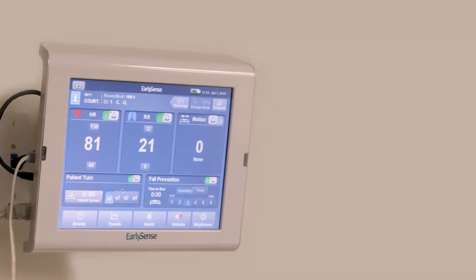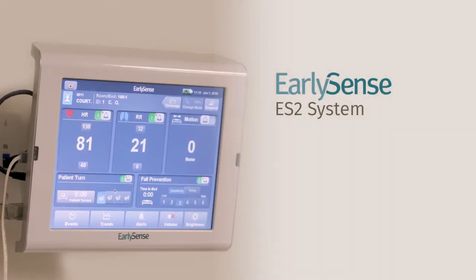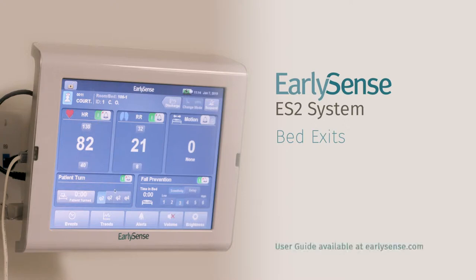Welcome to the EarlySense tutorial video. This video will demonstrate how to utilize the bed exit functionality for fall risk patients. For any elaboration on how to operate the EarlySense system, please refer to the relevant user guide provided upon installation or online at EarlySense.com.